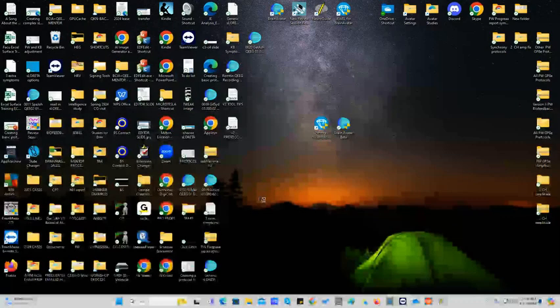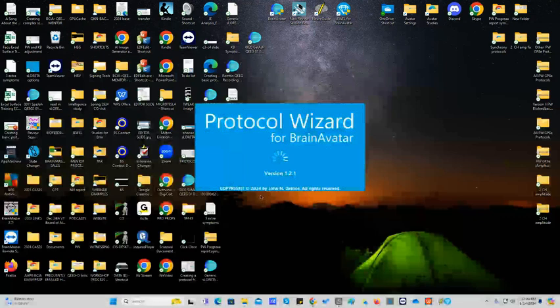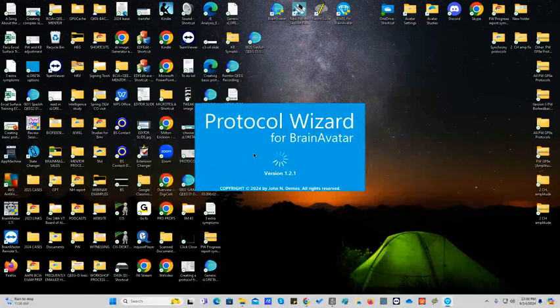Welcome to the Protocol Wizard for BrainAvatar. In this demonstration, we will show how to use the software to acquire and process QEEG data.